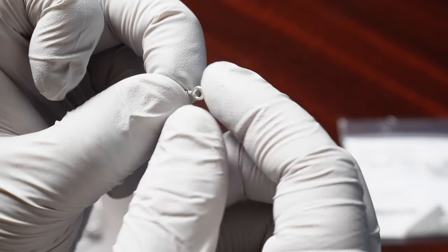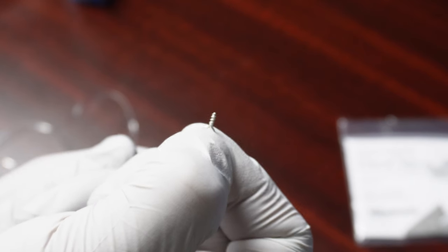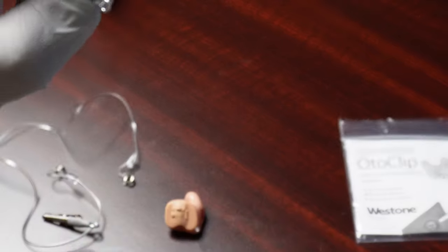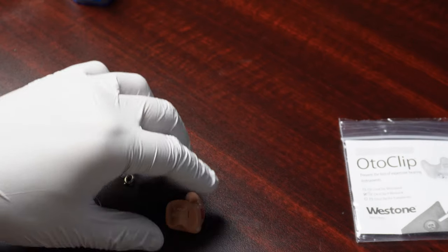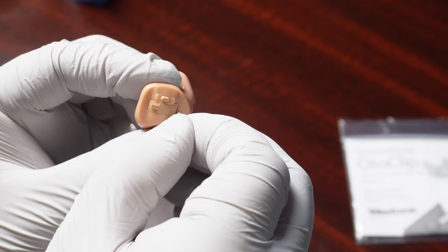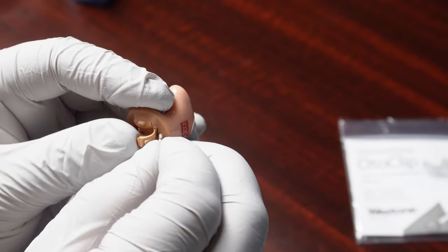Sometimes if you're holding the hearing aid upside down or in the wrong orientation, you might put that hole right above where the battery door opens up, so that you're not going to be able to get a battery in there. So open up the battery door on your hearing aid and make sure that, number one, the eyelet is going to be underneath the battery door, not on top of it, so it doesn't obstruct the battery from going in.